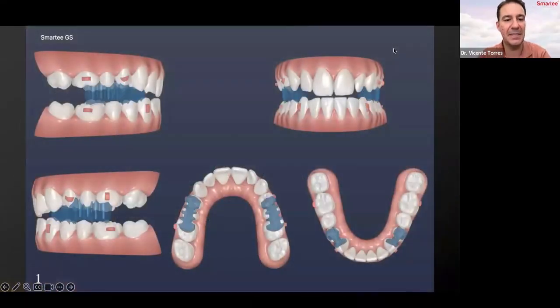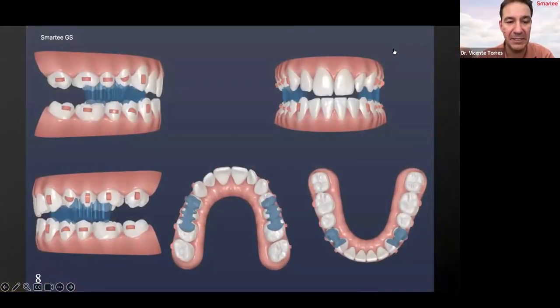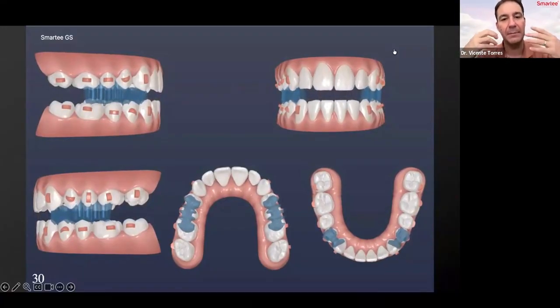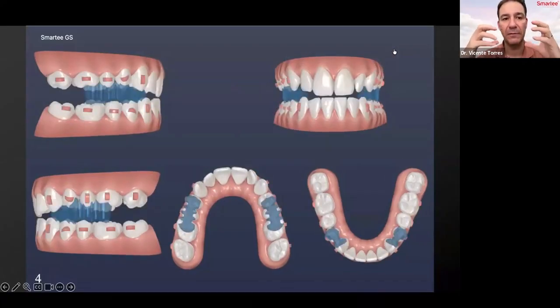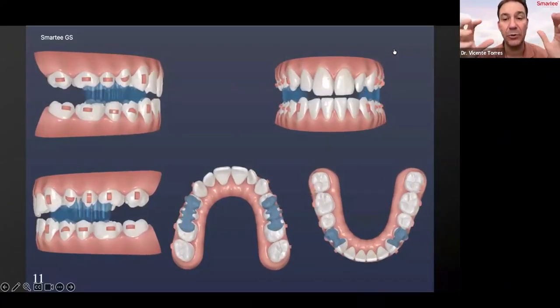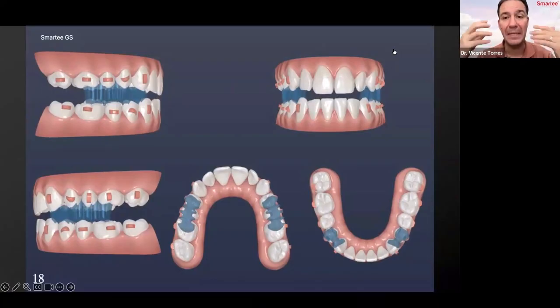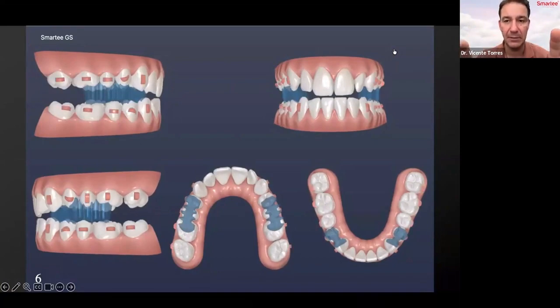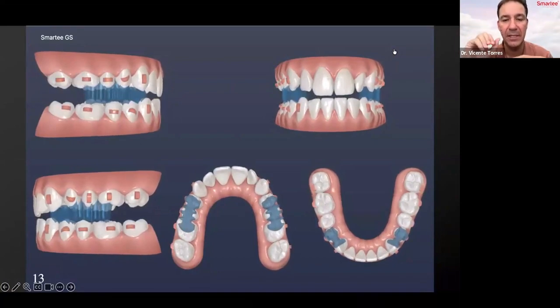And this is my treatment plan. You can see here the first 3 to 6 aligners are only for the mandibular repositioning at the beginning. The patient needs to use them during meal time, so it's very important to eat with the device. Right now I'm using only one kind of device, in this case the ACE TV.